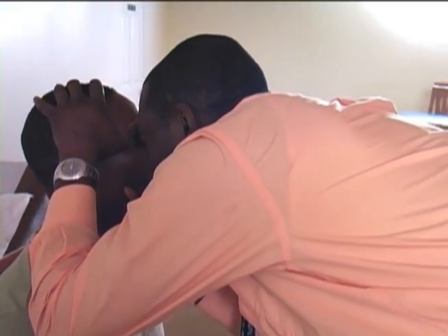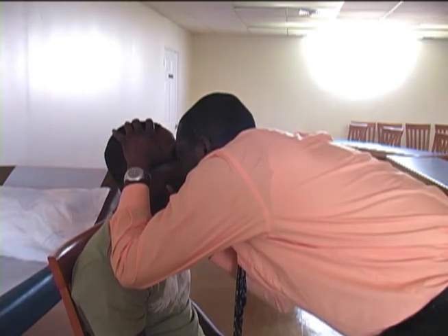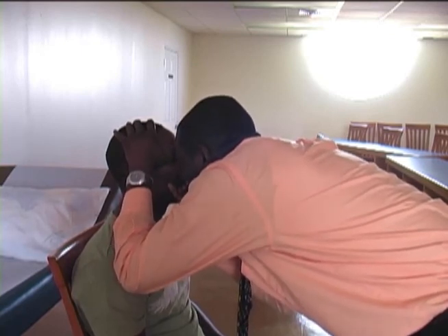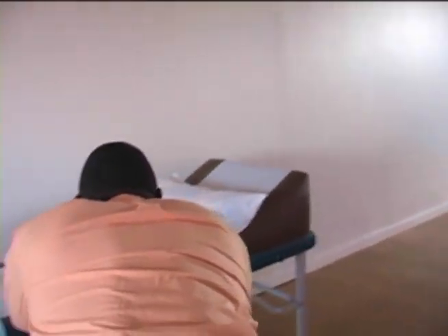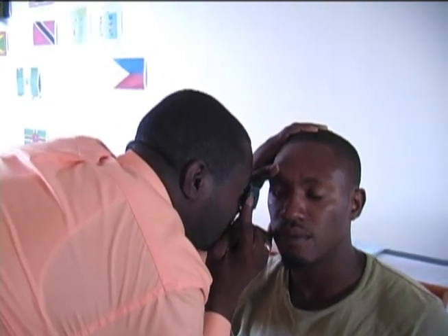Use the lens wheel to adjust the diopter, plus or minus, to get this vessel or disc in clear focus. The minus lens, which is myopic, are usually in red, and the plus lens, hyperopic, in black or green. If a vessel is seen, follow it to the optic disc. The size of the vessel increases as you move towards the disc. Do not turn the instrument to follow the vessel, as you will move the light away from the patient's pupil. Move your head under the ophthalmoscope as a unit.